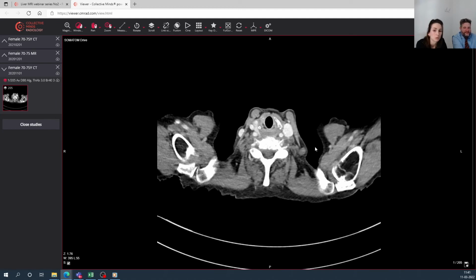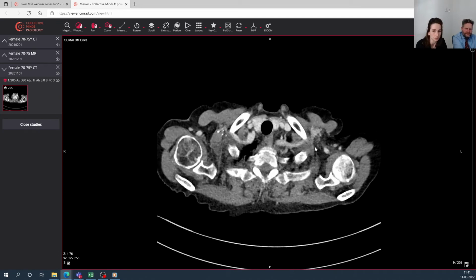Detection of the number of mets is to look if the number is different. Yes. And why is that so important, do you think? So I think it's important because a few years ago, multiple liver mets meant that there were no treatment options. Yes. And now there are still enough treatment options. If you have multiple mets in the liver, local treatment still has benefit if there are more lesions than 5 or 6. So it's very important to know how many lesions there are and where the lesions are.